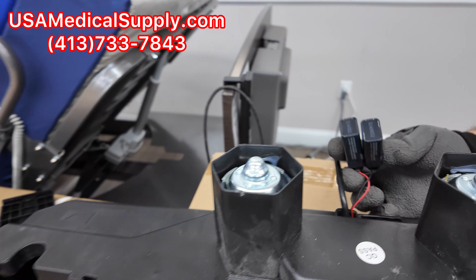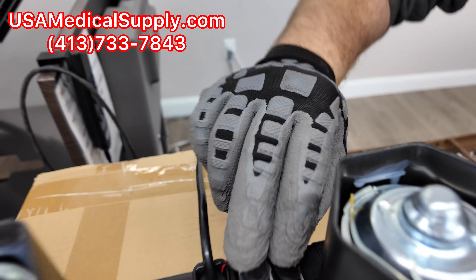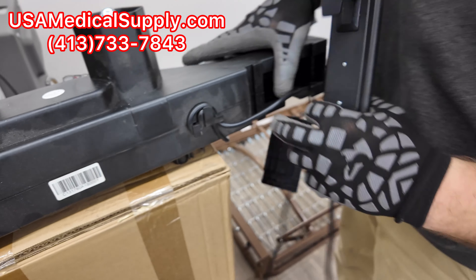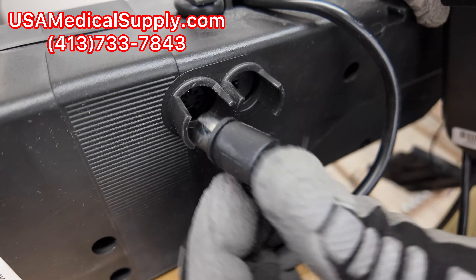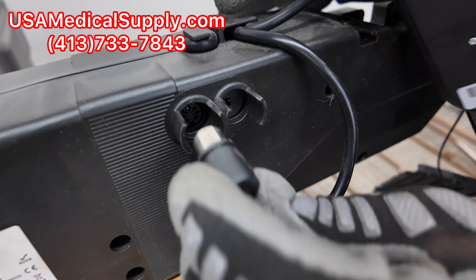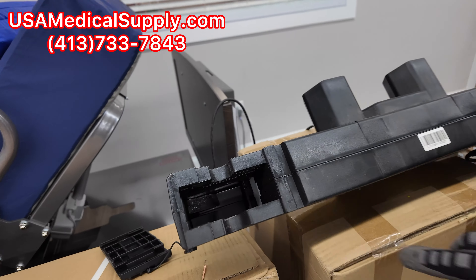When the motor comes in, it has spots for batteries. If the batteries are not installed, just put them in and tuck them in like that. It's also going to have the remote, coiled and plugged into the left side port. You cannot mix it up because the connector type only fits that port and only fits one way — there's a notch so you can't do it backwards. Just make sure it's plugged in and the motor is ready to go.